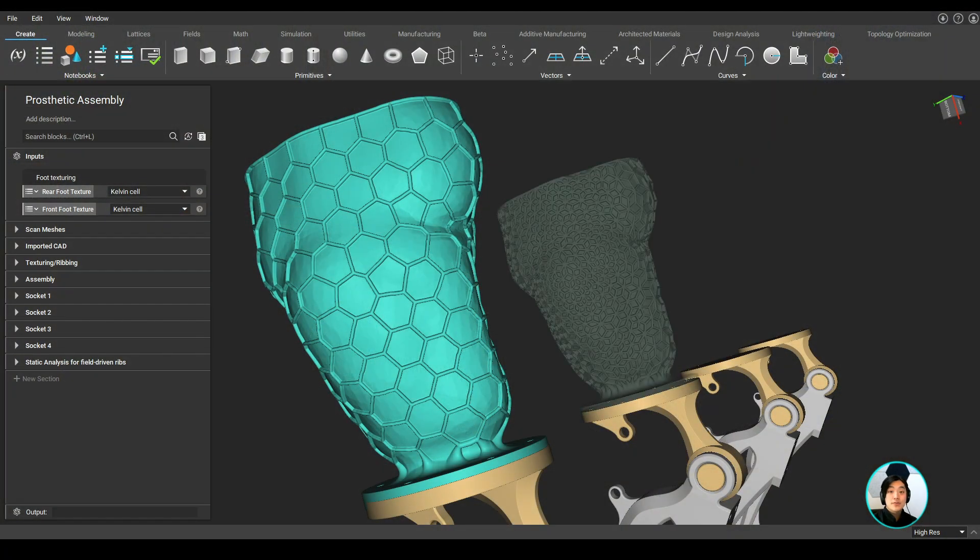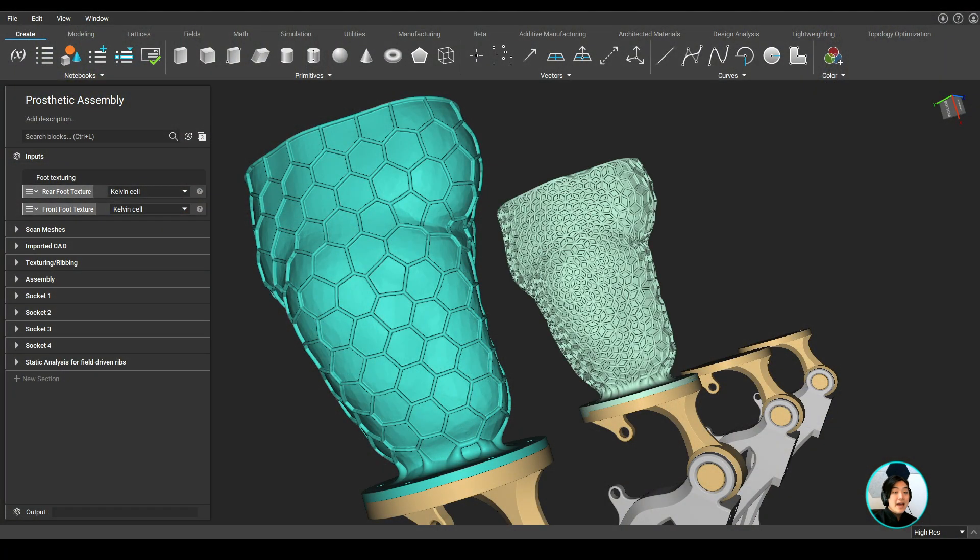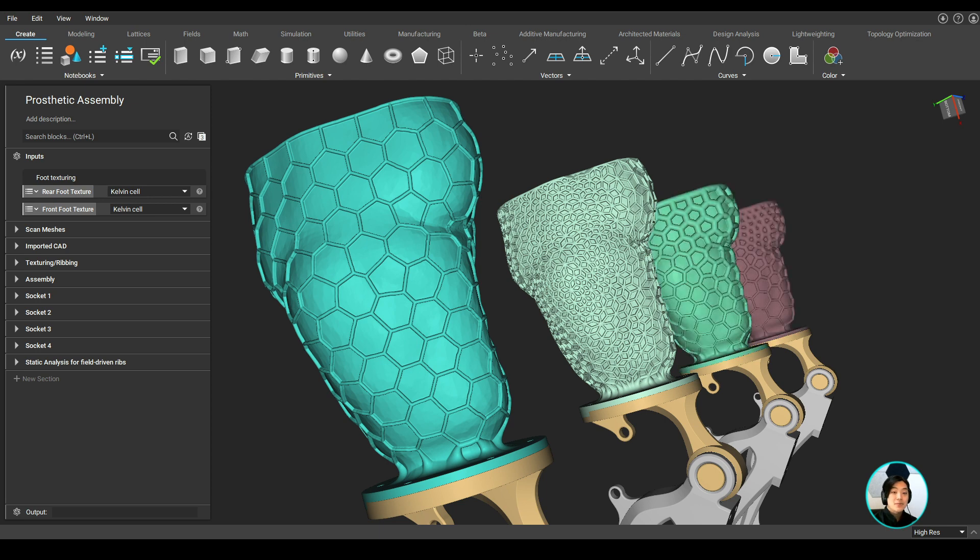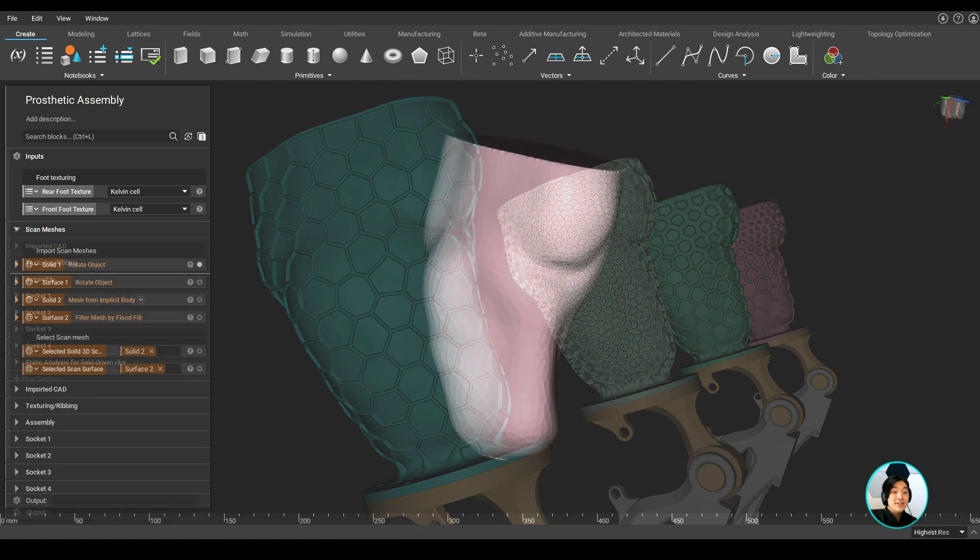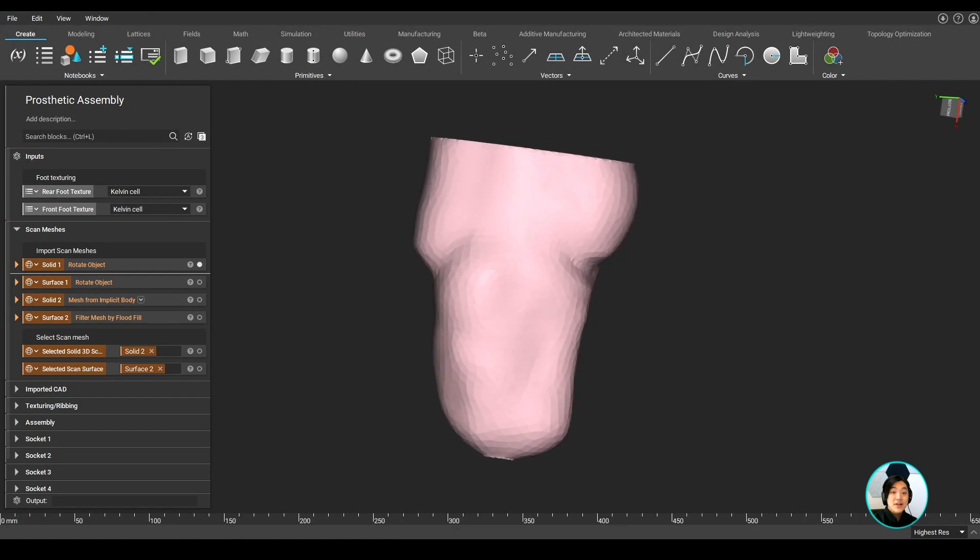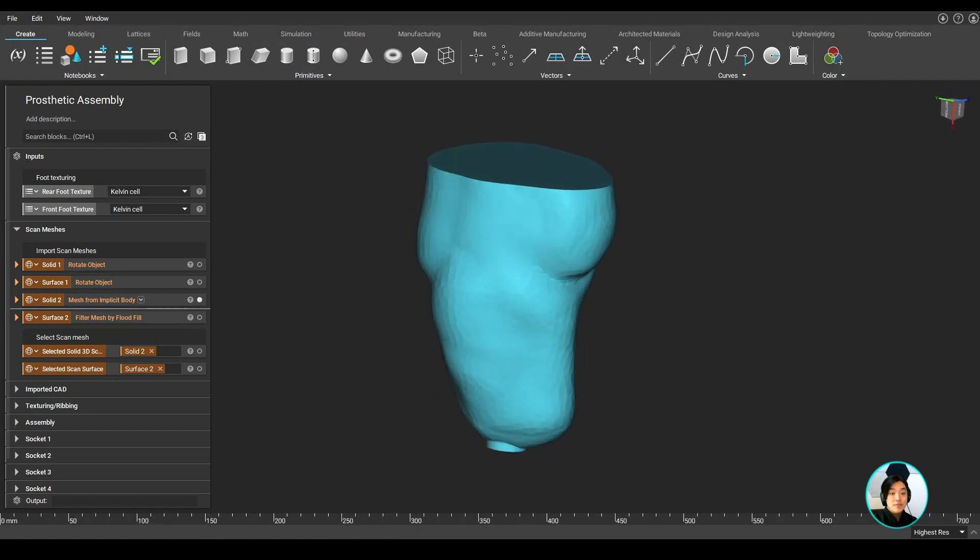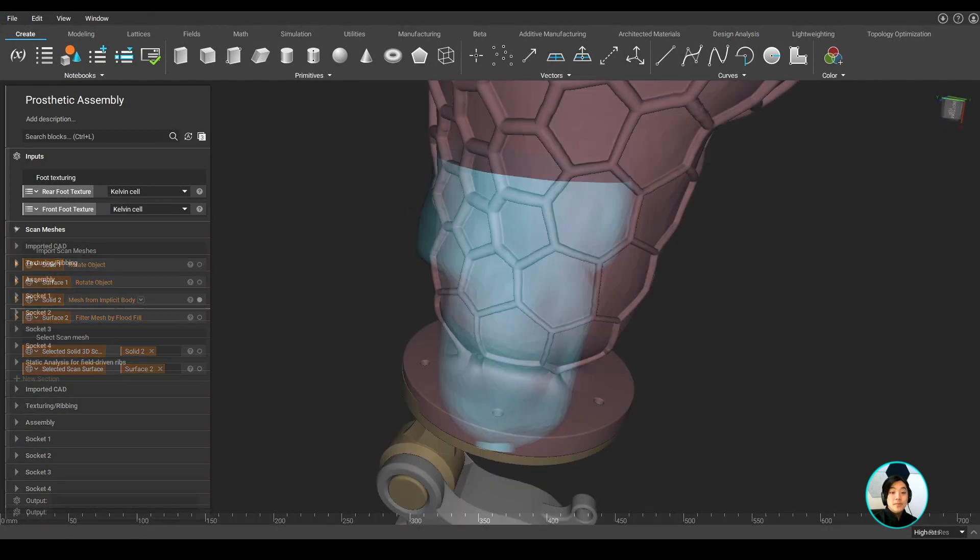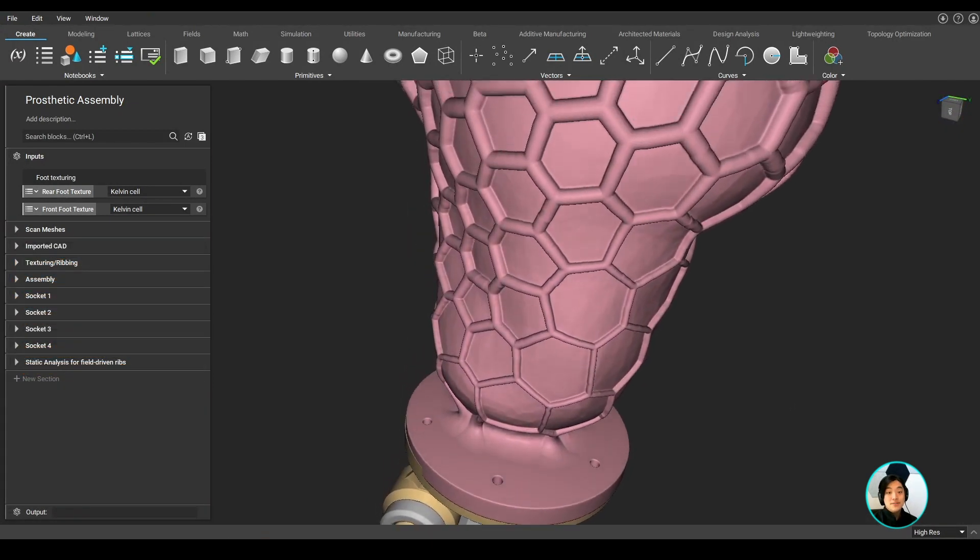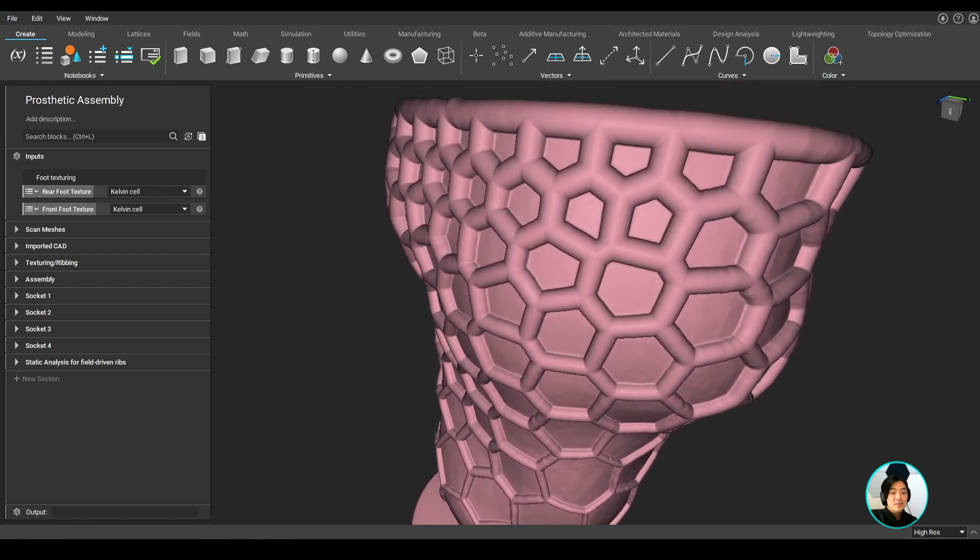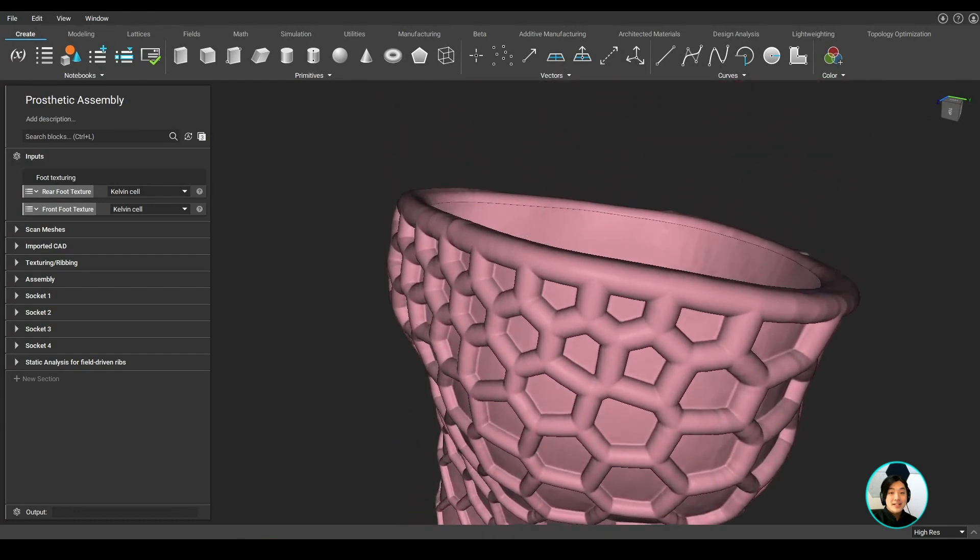nTopology lets you streamline reusable workflows and customize your existing products without compromising the original design intent. We can bring existing models into nTop and turn them into editable geometry, optimize the design for its use case, and easily add complex geometry like lattices.